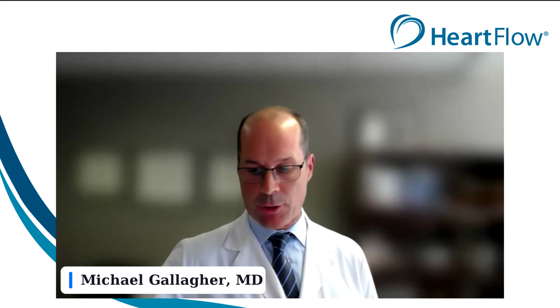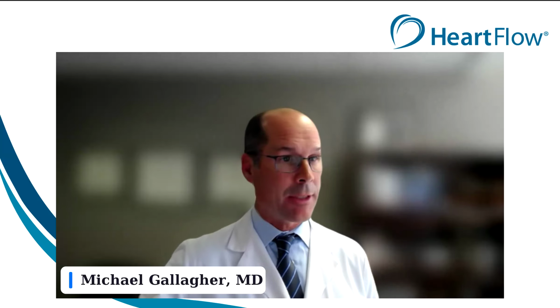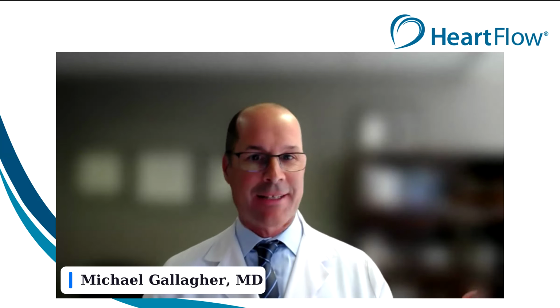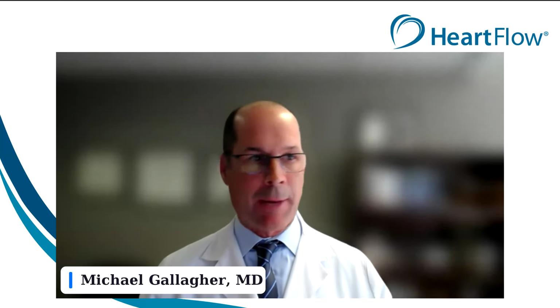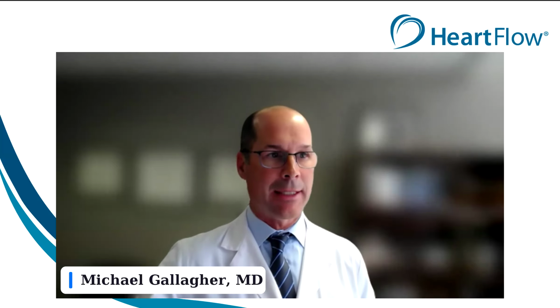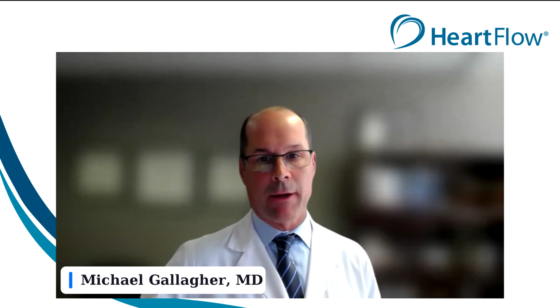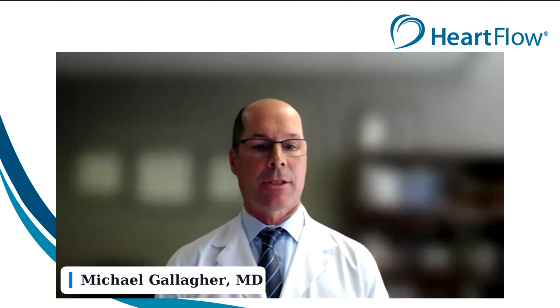When you look at that total plaque volume, atheroma percentage, low attenuation plaque, when you look at those features as calculated by AI, when you look at the incremental improvement above percent stenosis, absolute FFRCT, traditional risk factors that we all grew up with, when you look at any clinical traditional risk factor, it's quite striking that these AI variables stand out time and time again in these trials that look at 1 and 3 year cardiac events. So I think it's very provocative.